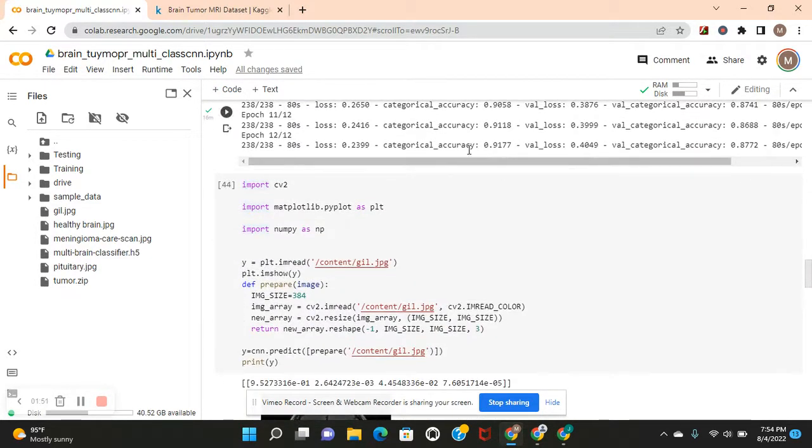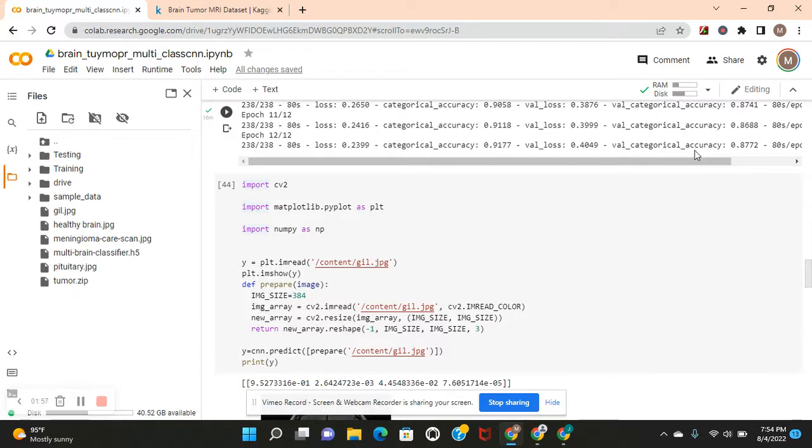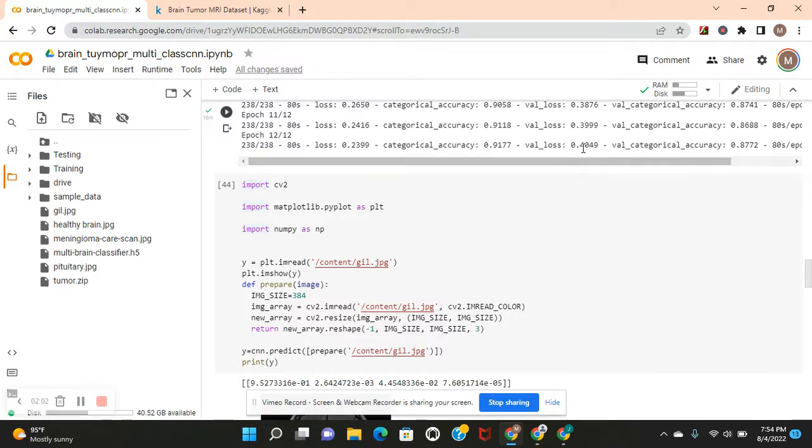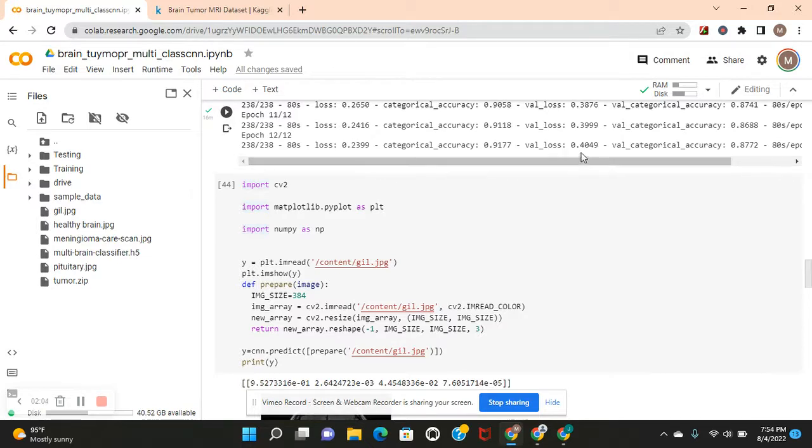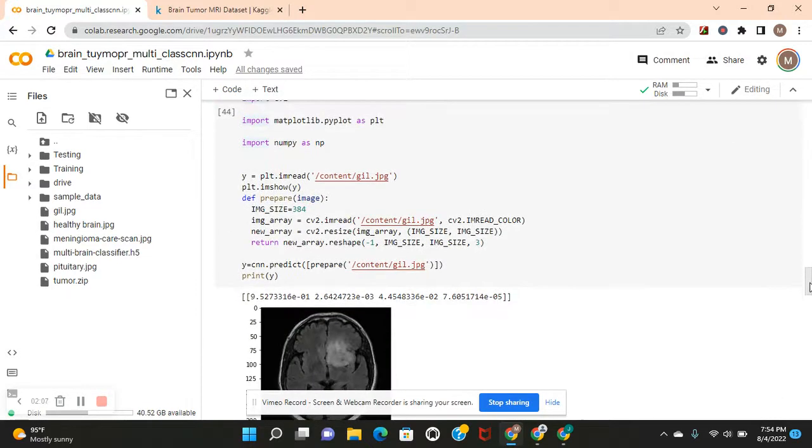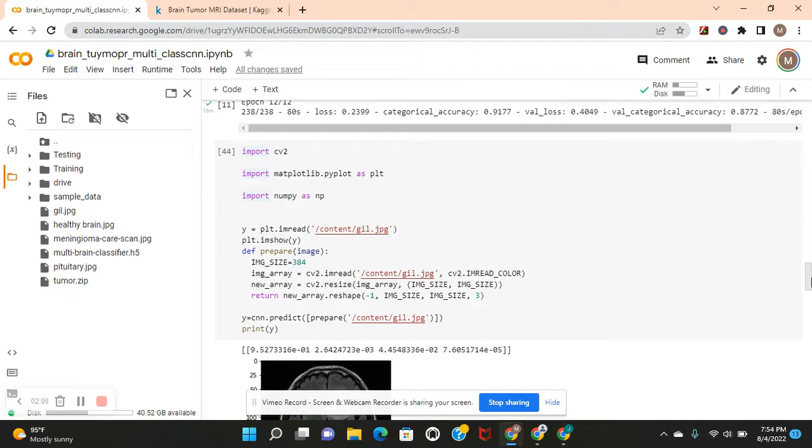As you can see, the last epoch, however, it could do even better. 91% categorical accuracy and validation 87%. Now guys, be aware at 15 to 18 epochs, it could do even better for the training and test loss as well as the metrics across the board.